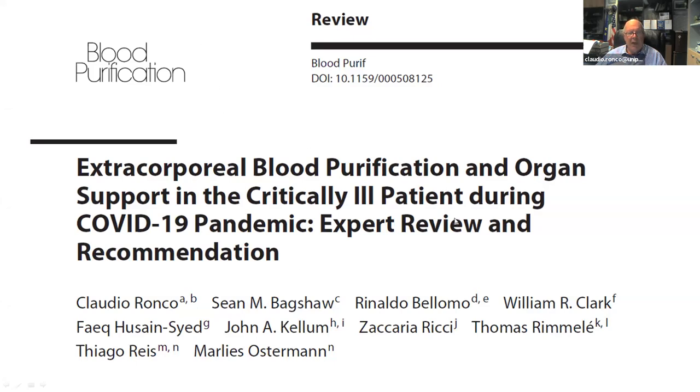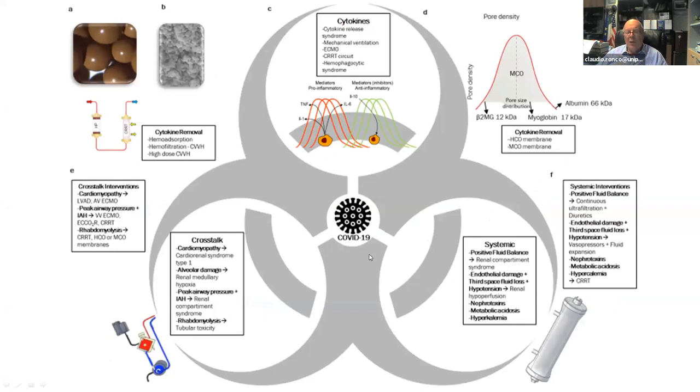are in blood purification, and you can probably have free access to this paper. As you can see, we have the most famous experts publishing this expert recommendation. So in conclusion, COVID-19 infection can somehow be treated with extracorporeal therapies for several different reasons, including oxygen provision through extracorporeal membrane oxygenation, cytokine removal through hemoadsorption and hemoperfusion. Cytokines can actually be removed, at least at the peak concentration, resetting the immunohomeostasis of the patient.